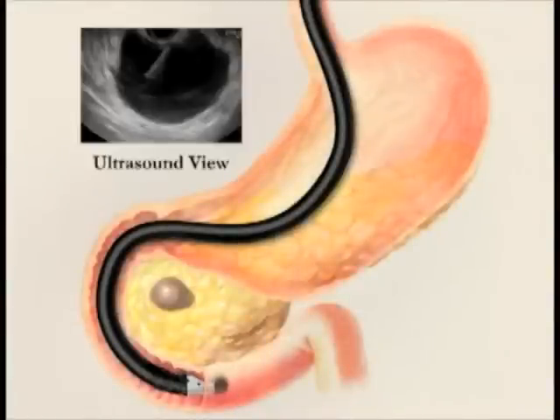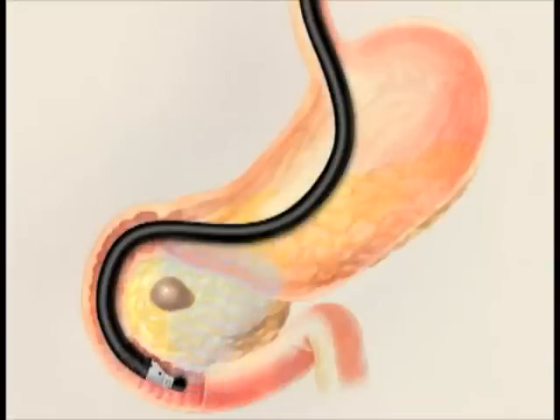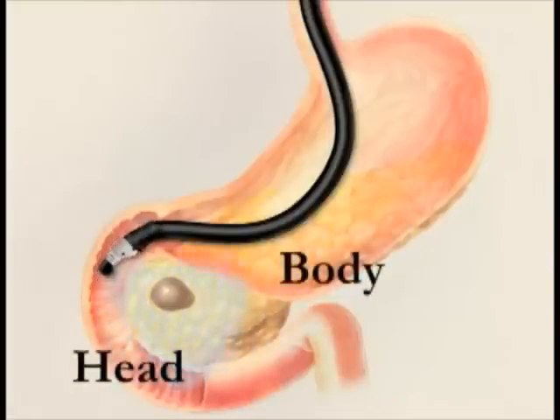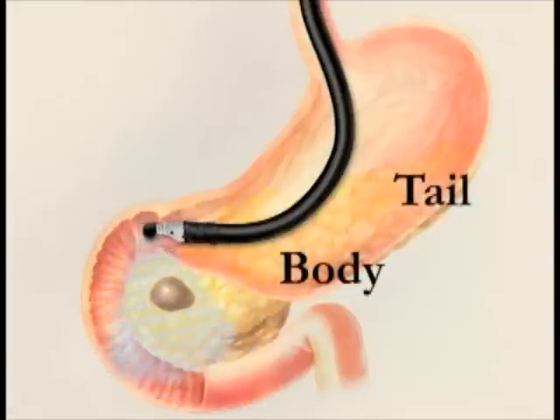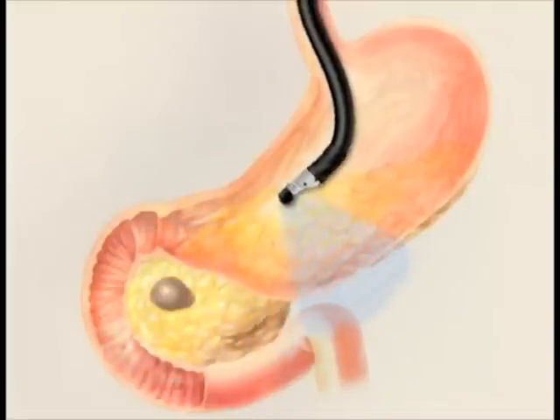In the ultrasound view, sound waves are passed through the lining of the stomach and into the pancreas to generate a clear image of the pancreas. The ultrasound probe is then withdrawn towards the stomach and moves along to examine the head, body, and tail of the pancreas for possible cysts.